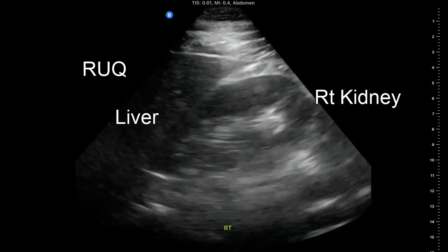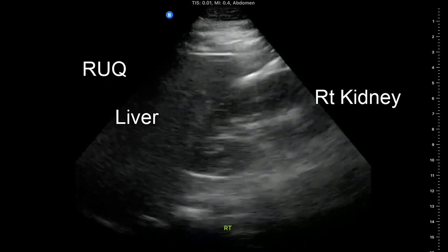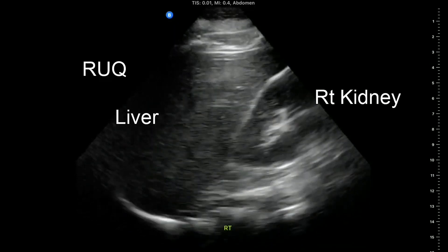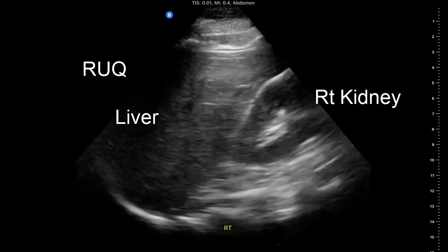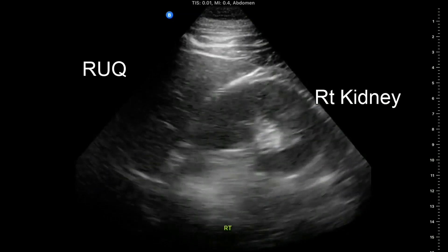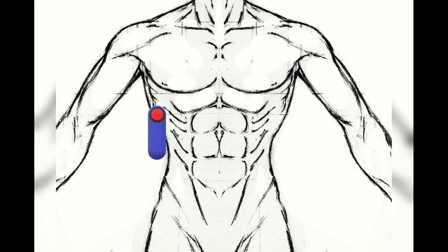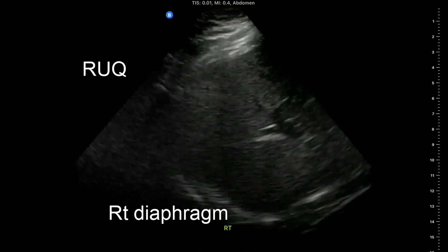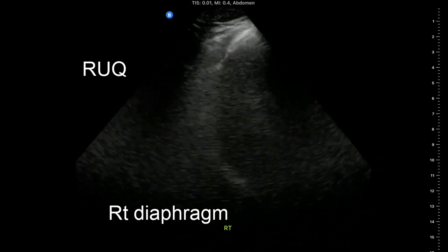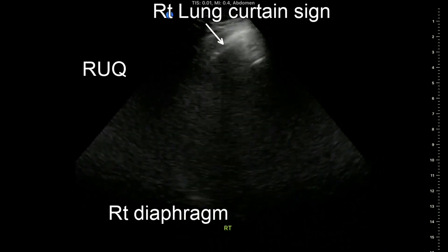The right upper quadrant view, or perihepatic view, is commonly regarded as the classic image of trauma ultrasound. It allows visualization of free fluid in the potential space between the liver and right kidney. The transducer is initially placed in a coronal orientation in the mid-axillary line over an intercostal space of one of the lower ribs, with the indicator directed toward the patient's head. Fluid above and below the diaphragm in the costophrenic angle or sub-diaphragmatic space can also be seen.